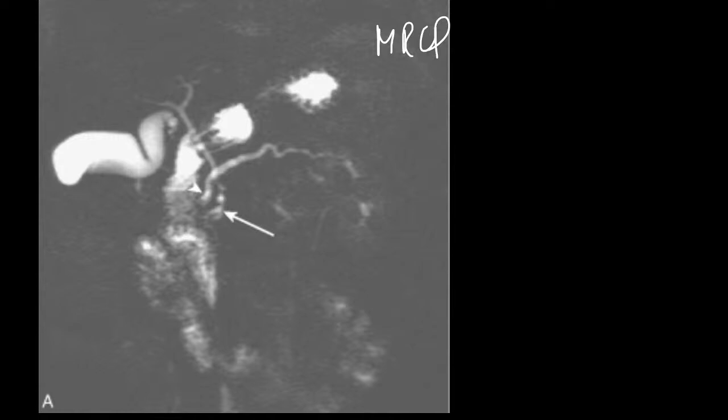Phrygian cap, okay, that is normally present. Phrygian cap is normally present, so that is not an abnormal thing. Anything else? So very well pointed out by Dr. Shoaib Ayubi. Okay.